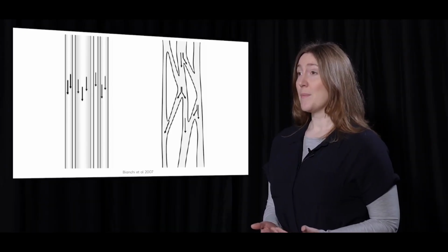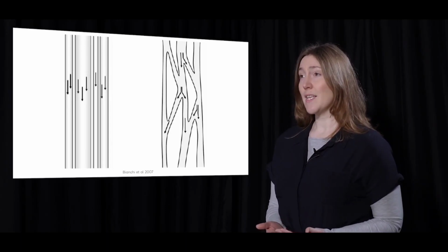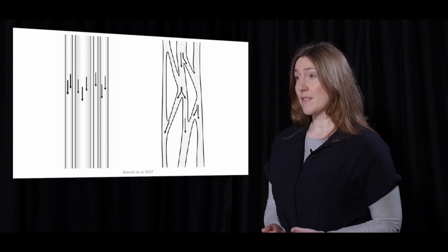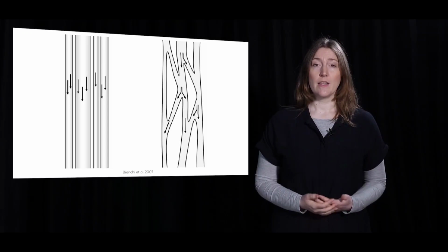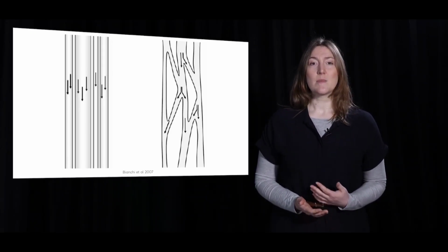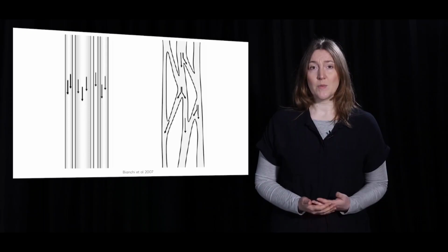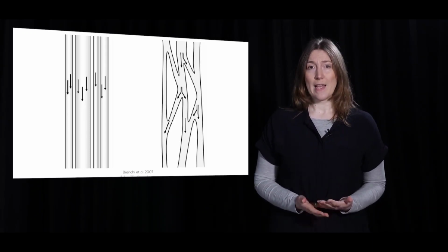In this slide you see schematic drawings of a longitudinal view which illustrates the models of fascicular organisation. The arrows are indicating the axonal path. In the cable model, depicted in the left image, the fascicles run parallel to the nerve axis without axonal exchange. In the plexiform model, depicted in the right image, fascicles split and rejoin in various combinations with axons intermingling from one to another. Be aware of the plexiform model if you're following a nerve.